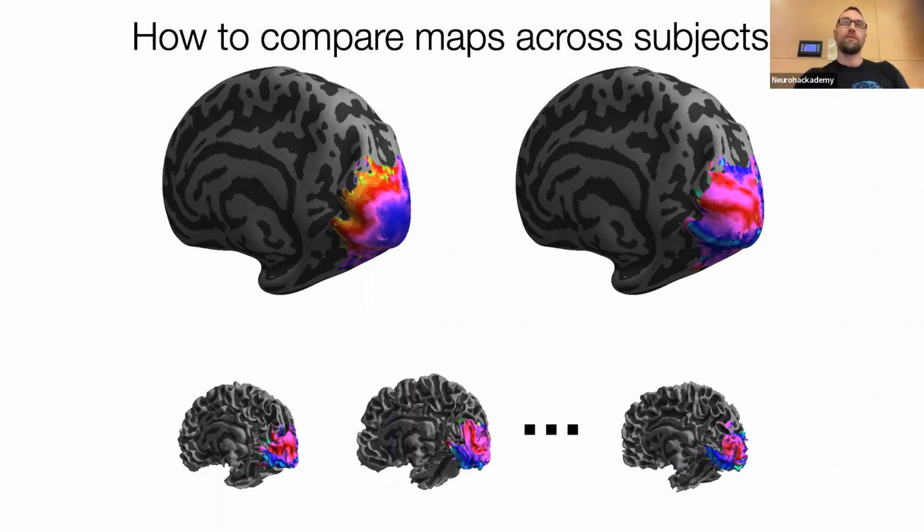I think one of the most innovative things it does, and in fact it did all the way back in the 90s, was tell us how to compare subjects using anatomy, or how to align subjects using anatomy in a way that wasn't just about a rigid body transformation. So I've just got a few slides here that explain very simply what FreeSurfer does to do this process, because I think that often this process is very opaque to people.